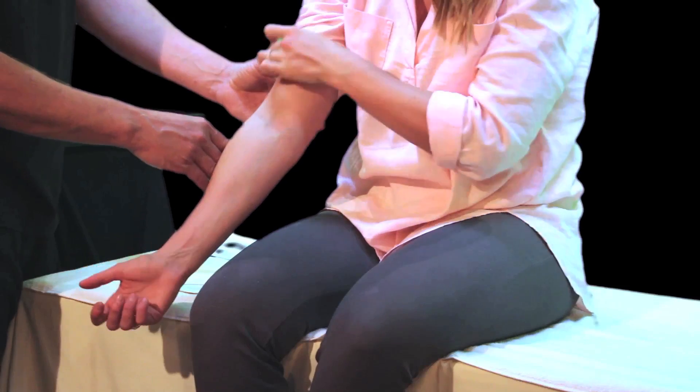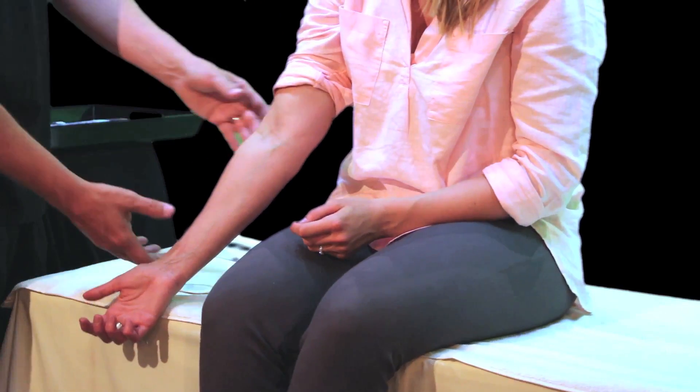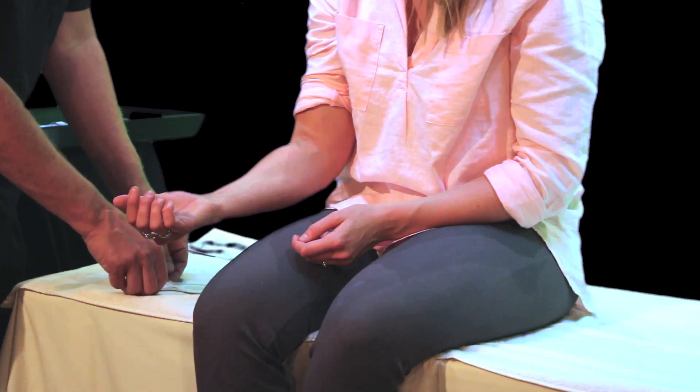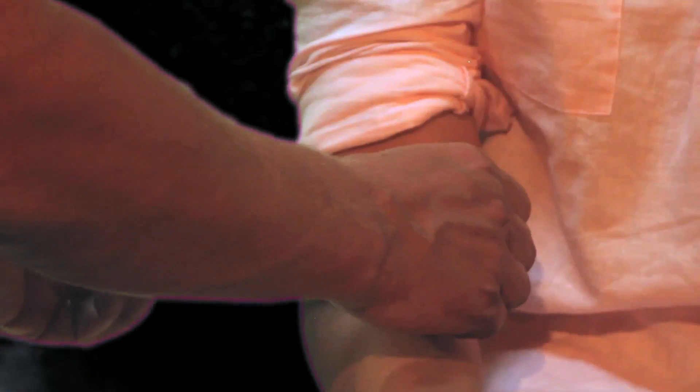We're going to be applying on the elbow. Any joint you want to have in a half flexed position. Place the positive patch on the site of the injury. Push with your fingers on the edges where the adhesive is. Do not push down on the medication.